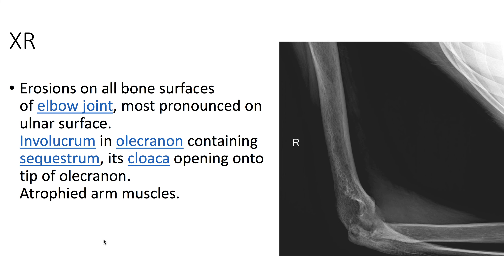X-ray of the right elbow shows erosions of all bone surfaces of the elbow joint, most pronounced on the ulnar surface. We see a sequestrum and a surrounding involucrum in the olecranon, with a cloaca opening onto the tip of the olecranon.